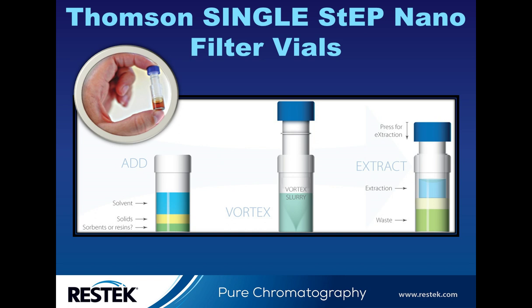It contains mainly two parts, the bottom shell and the top plunger with the filter in it. First, you transfer your top layer or the supernatant to the bottom shell. Then you insert your plunger with the filter into the shell halfway down. At this step, you can either vortex, shake, or whatever is necessary. And then you press the top plunger all the way down to the bottom of your shell. In this case, you have filtered your sample.